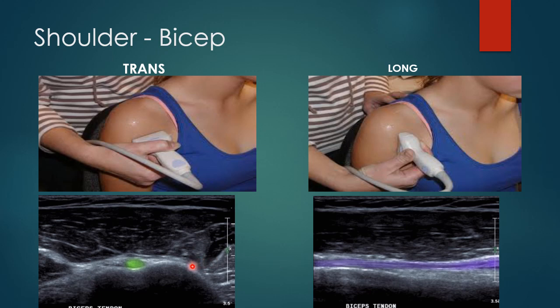A main differentiating point is that in cases of tenosynovitis, we will find the tendon more thickened. We can use a comparative study with the other side. Also, we can find increased vascularity on Doppler study. Moreover, the effusion from tenosynovitis is usually not compressible during the compression that we can use in our study, as mentioned before.